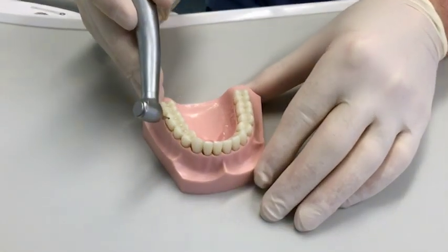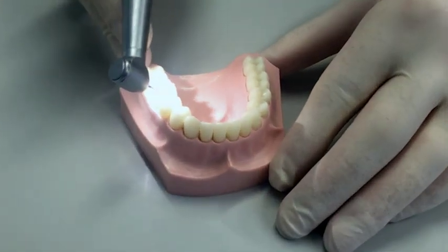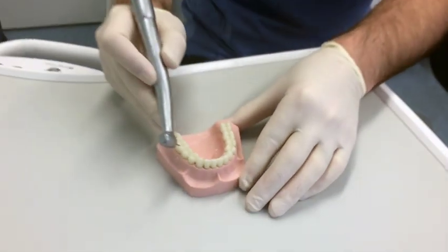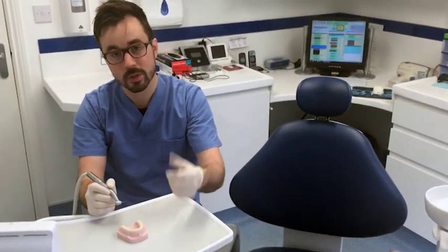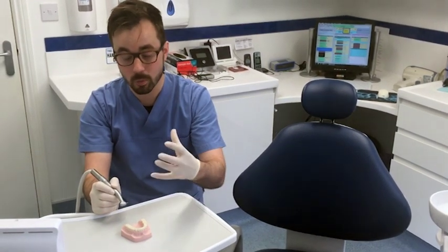I'll just give a quick demonstration of it on this plastic model. You can see the light illuminates, and there's also a jet of water to keep the tooth cool while we're actually drilling.